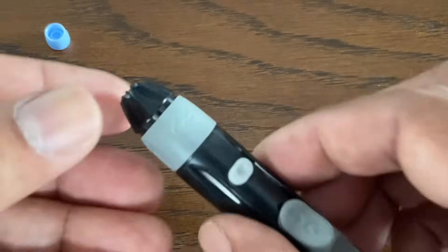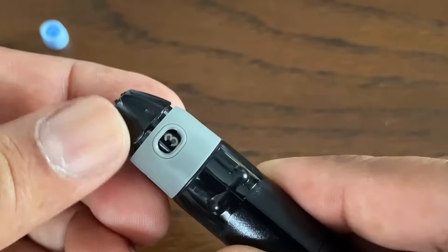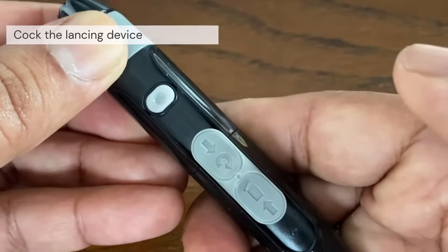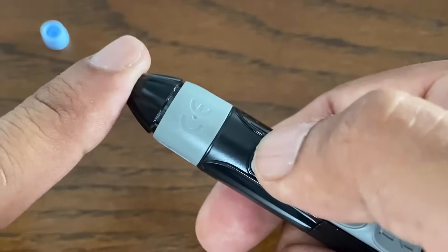The next step is to adjust the depth setting. The device has 9 puncture depth settings. Next, load the lancing device by pulling the slider back until it clicks. If it does not click, it may already have been loaded when you inserted the lancet. Hold the lancing device firmly against the side of your finger and press the release button.